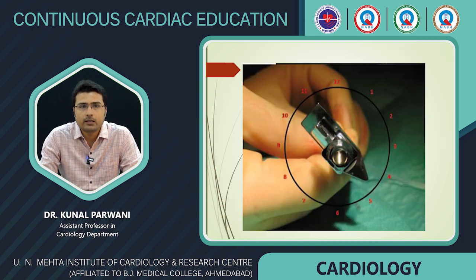This is the indicator that is available with the Brockenbrough needle. It helps us in knowing where the needle tip would be. As you can see, it can rotate 360 degrees in a clockwise and anticlockwise direction, and it helps us to make a safe transseptal puncture.